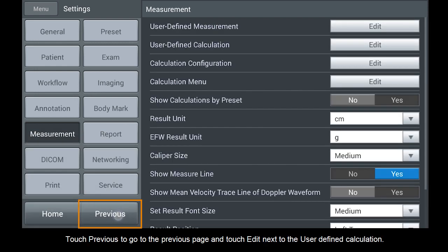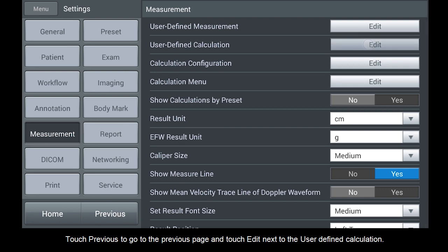Touch Previous to go to the previous page and touch Edit next to the user defined calculation.